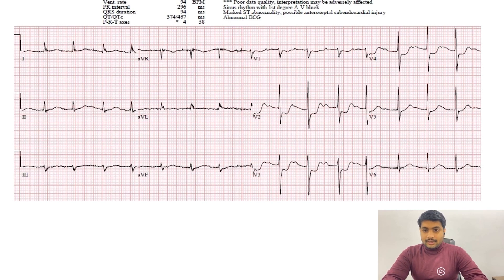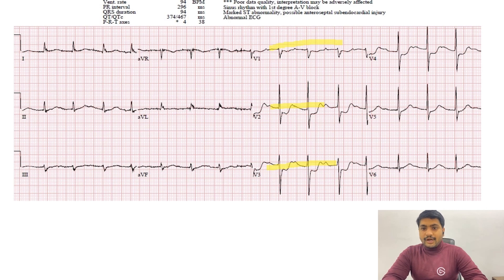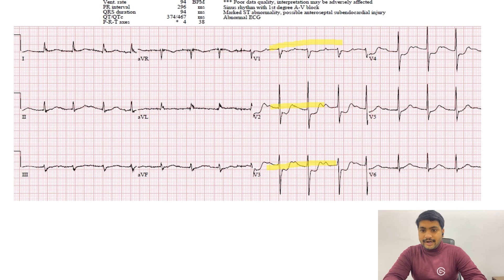So this is our first example. If we look at lead V1, lead V2, and lead V3, what we see is ST segment depression, upright T wave, and prominent R wave. This is the criteria for posterior wall MI — prominent R wave, shelf-like ST segment depression, and upright T wave.